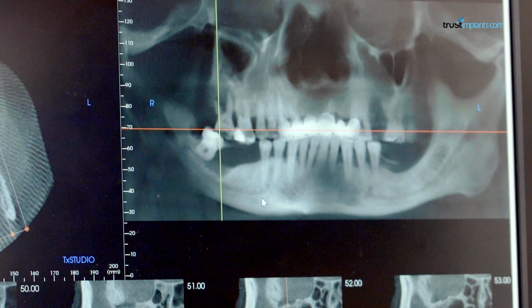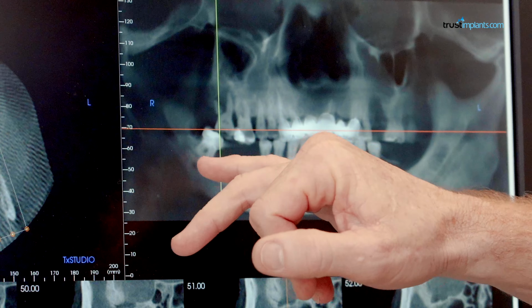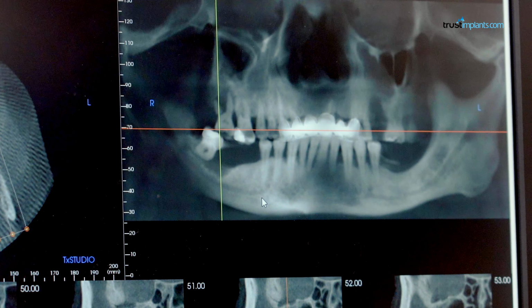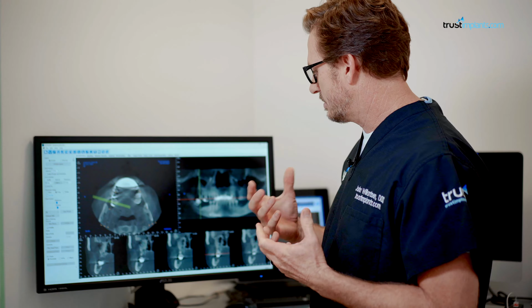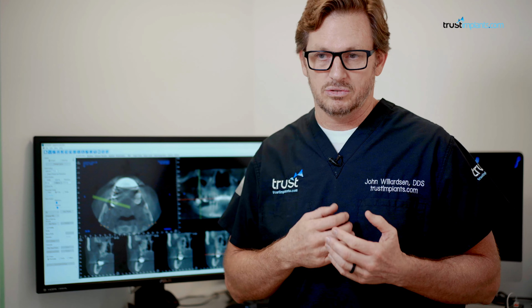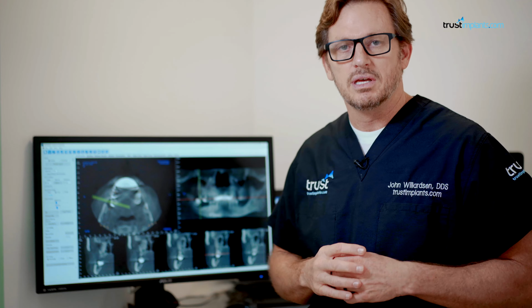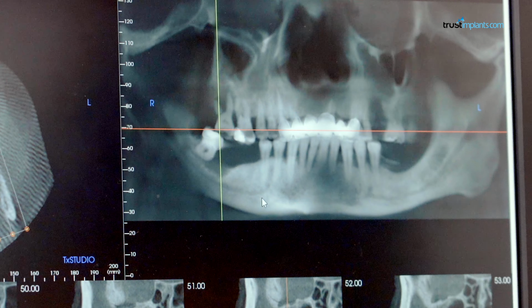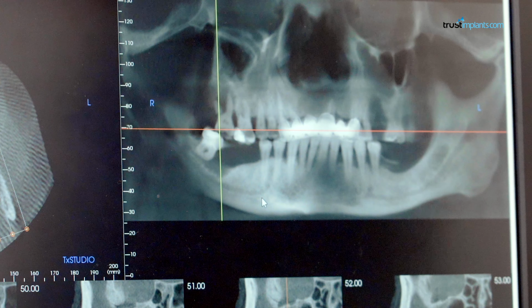So you'll notice here, he has some bone defects. So for example, this molar here on the lower right-hand side, the body's been trying to eliminate that tooth for a long time. And what it does is it destroys the bone. The periodontal disease and the acidity that occurs after having that bacteria just sit there over time, it just eats the bone away.